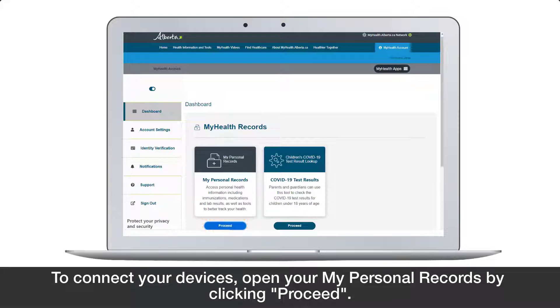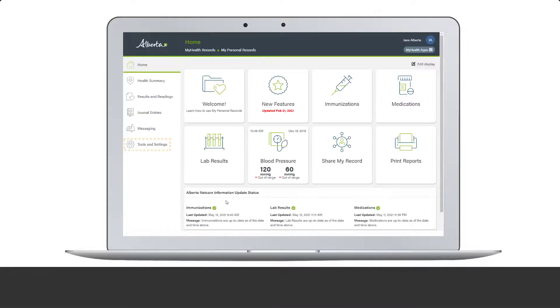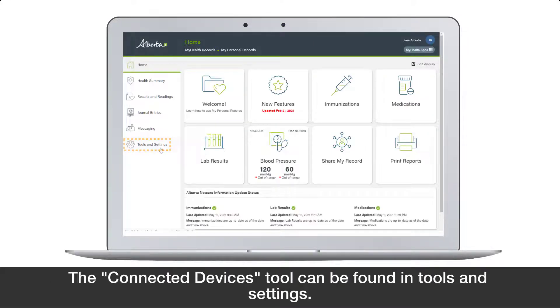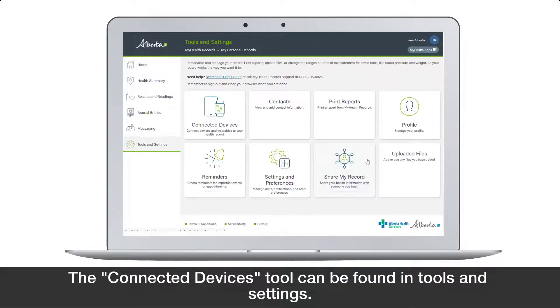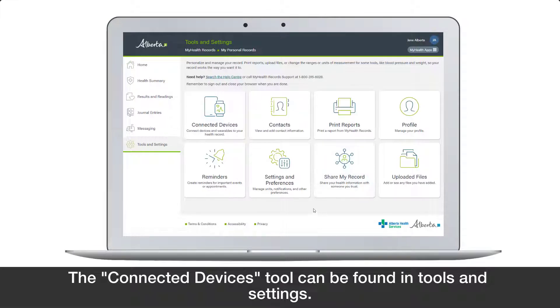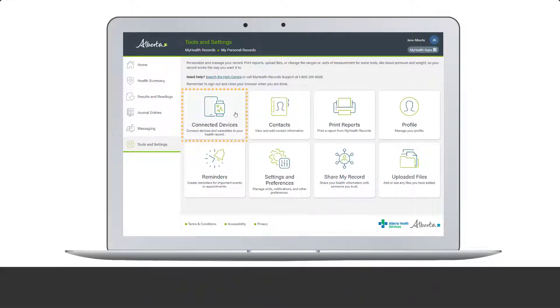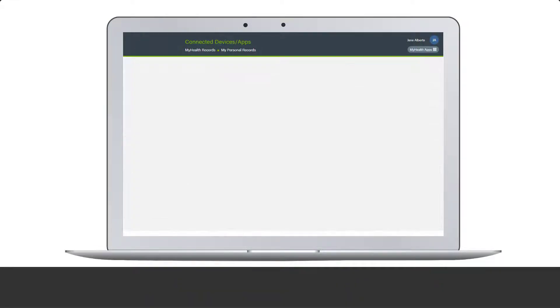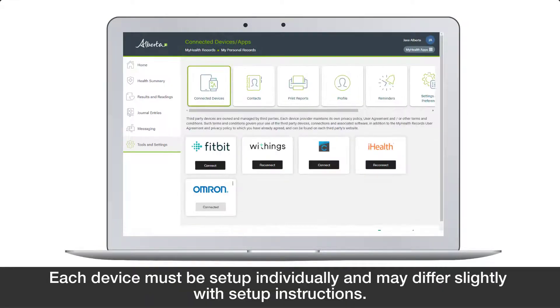To connect your devices, open your My Personal Records by clicking Proceed. The Connected Devices tool can be found in Tools and Settings. Each device must be set up individually and may differ slightly with setup instructions.